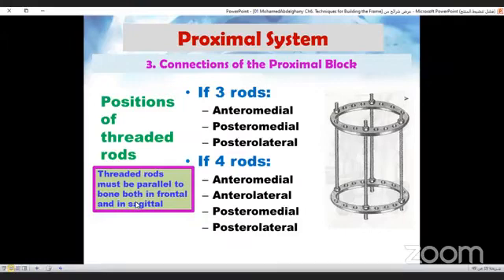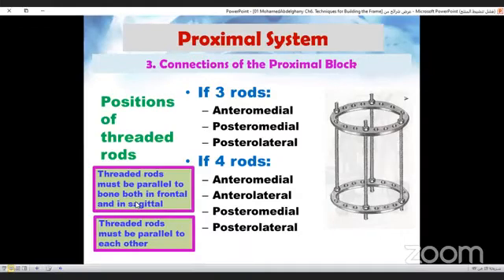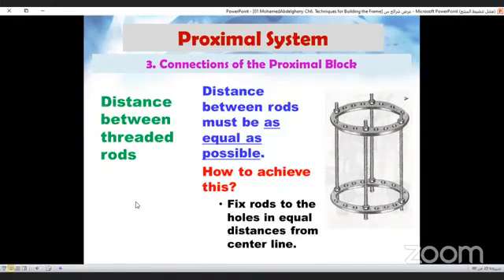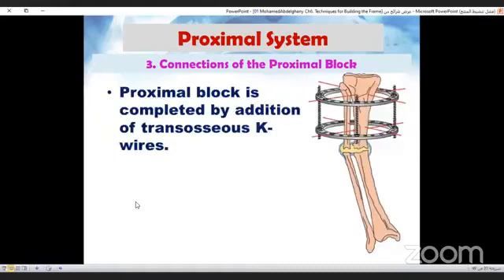Threaded rods must be parallel to the bone both in frontal and sagittal, and must be parallel to each other. The distance between the rods must be as equal as possible. To achieve this, the rods must be fixed to holes in equal distances from the center line. The proximal block is finally completed by addition of transosseous K wires.